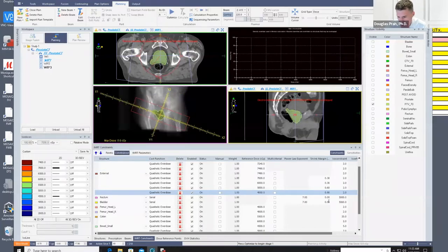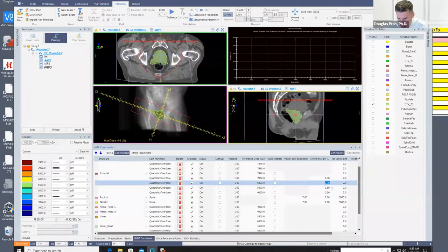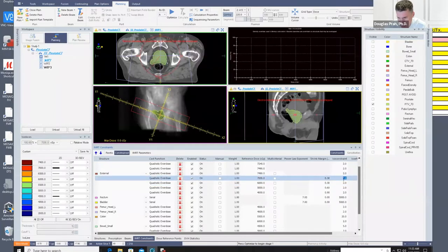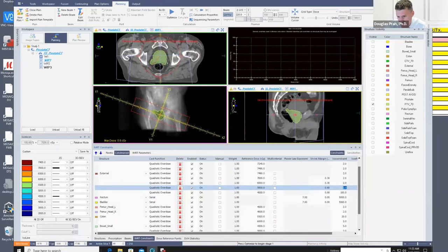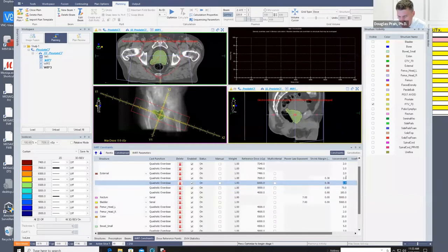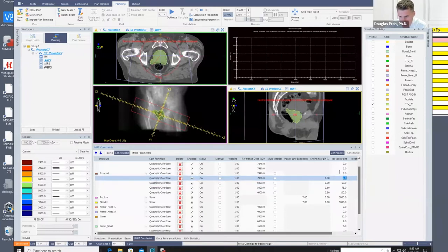Okay. Now you can see here, I did give myself a little wiggle room on the 70. So my guess is this might push a little, but I strongly encourage you, you should give the optimizer a little more flexibility for these higher numbers when you're doing this. So I tend to not keep the root mean square error quite so tight on these. For the prescription line, it can be helpful to start with a value of 2, like 2 to 5 in that sort of range is a good starting point. The tighter you make this number, the tighter the isodose lines are going to be.